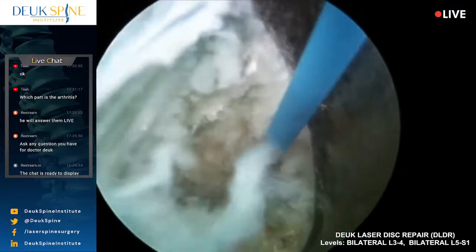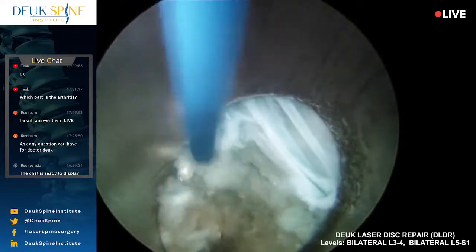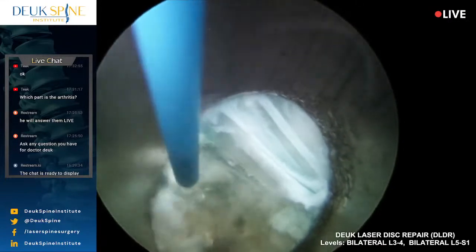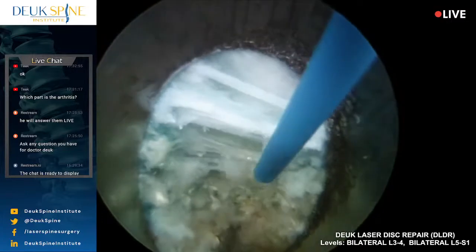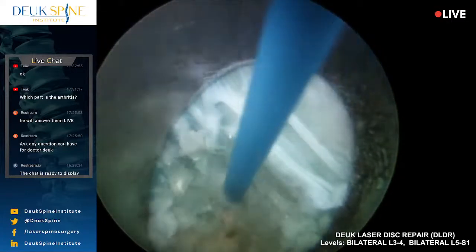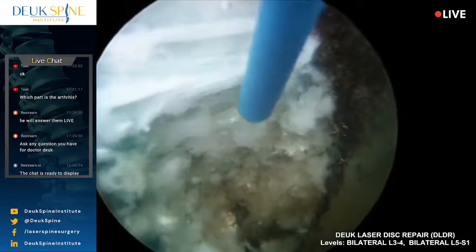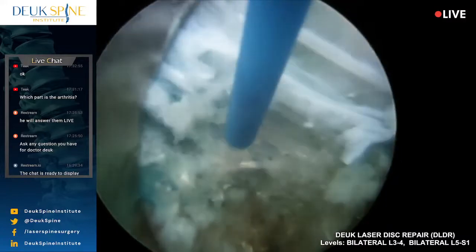It's a lateral disc. It's in the foramen. You know, just superficial to that is out in the foramen laterally, and you don't want to go there. It's no man's land. Stay away from it. There's bad things out there. But otherwise, this looks really good.